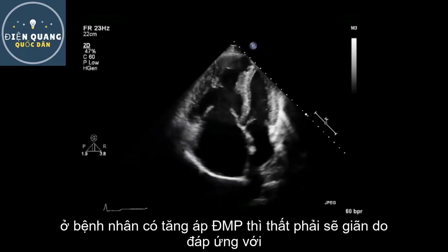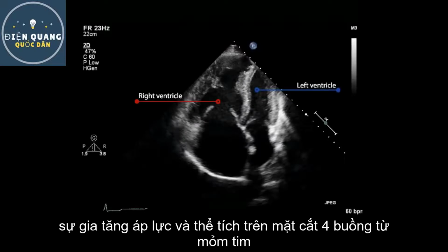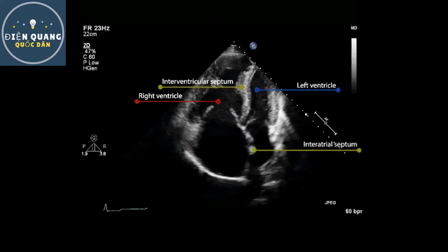In pulmonary hypertension, the right ventricle dilates and hypertrophies in response to pressure and volume loading, as can be seen in this apical four-chamber view.